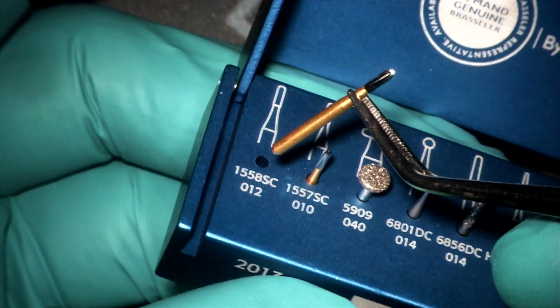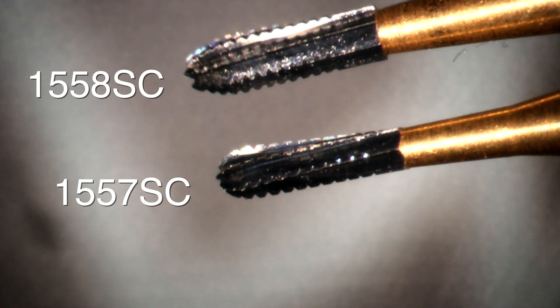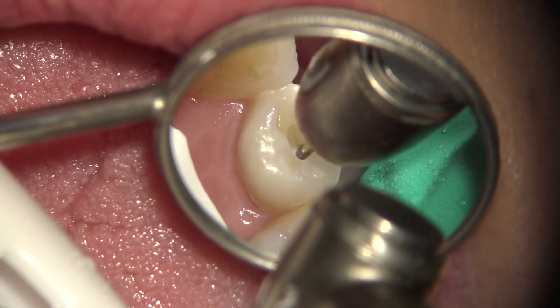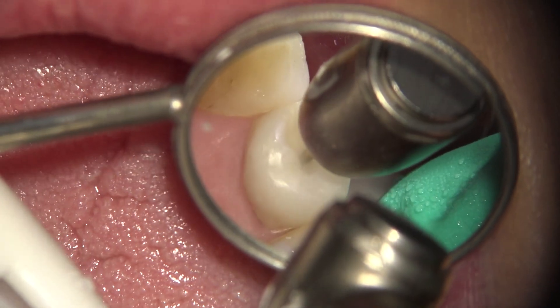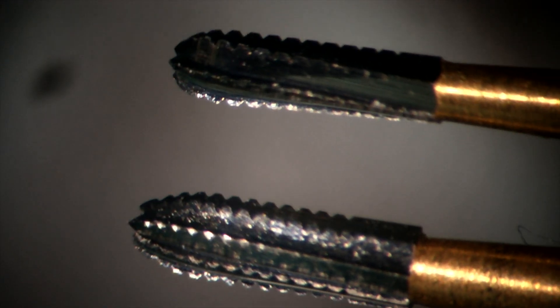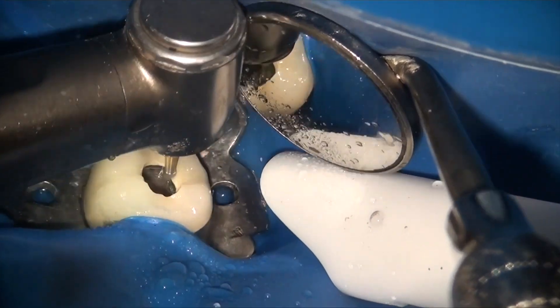The first two burrs in the kit are outline burrs. The 1557 and 1558 saber-cut burrs are rounded cross-cut fissure burrs that can cut efficiently through a variety of metallic and non-metallic restorative materials as well as enamel and dentin. These two are the bread-and-butter burrs I use in almost all cases. I use the thinner 1557 on smaller occlusal tables such as anteriors and premolars, and the thicker 1558 saber-cut on molars. The closest equivalent are the Great White burrs by SS White. The main advantage of the saber-cut burrs is that they are milled from a single piece of metal — not welded at the tip — eliminating the susceptibility to fracture at that point.